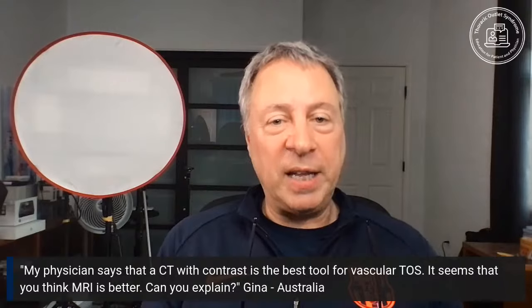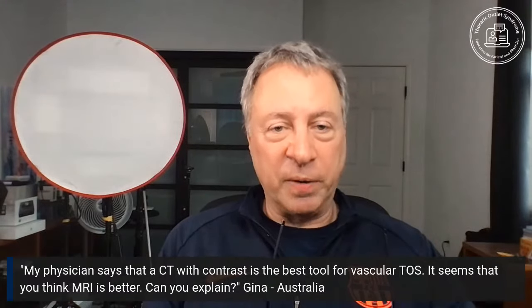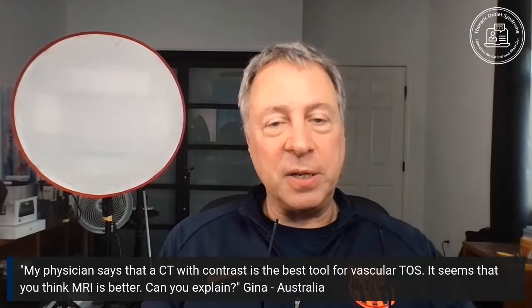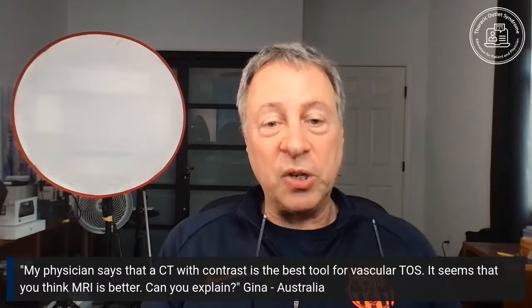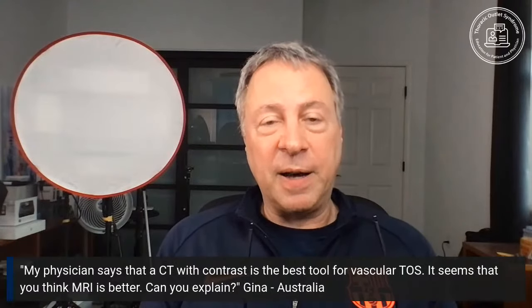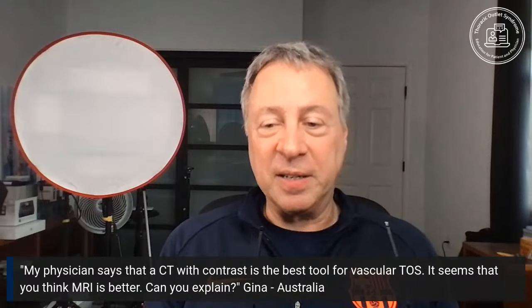So if I see a scalene muscle that is too big, I can see if it's pressing on the artery or not. That would not be easy to see on a CAT scan. All right, so it's a little bit of a complex question. I appreciate that, and I hope I gave you an answer that makes sense. You can ask further if I didn't.